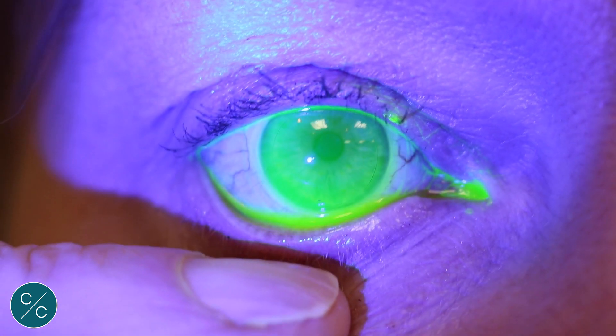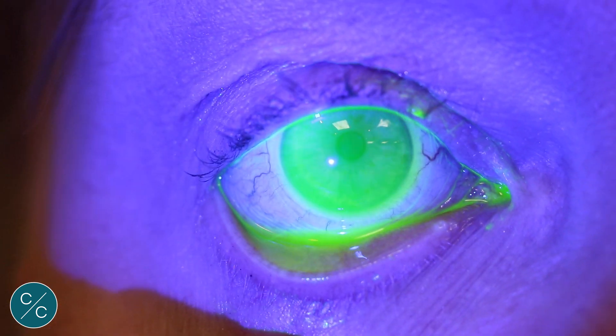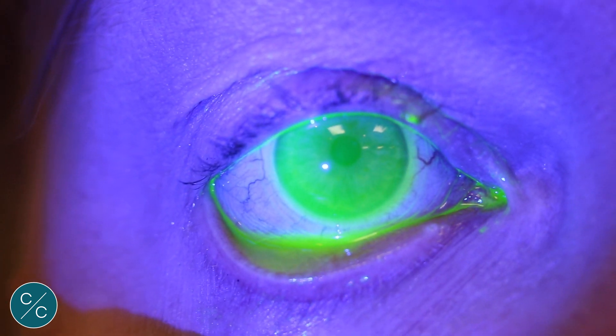So we've changed the lens now — we've gone 250 microns higher — and we can see now that there's fluorescent underneath the lens, no air bubbles, so we can proceed with the fitting.